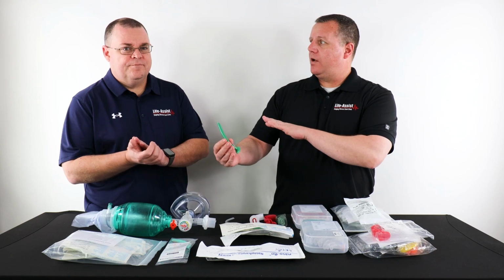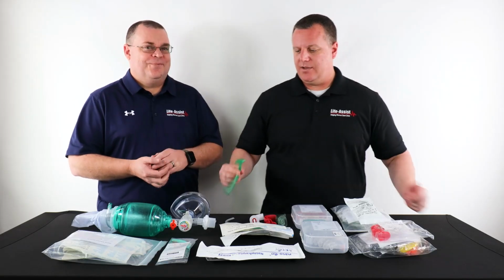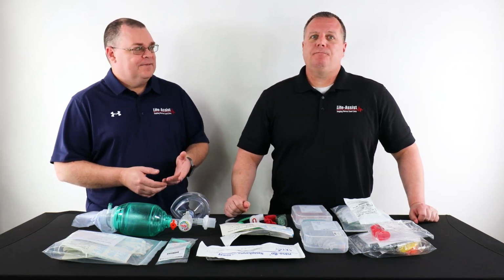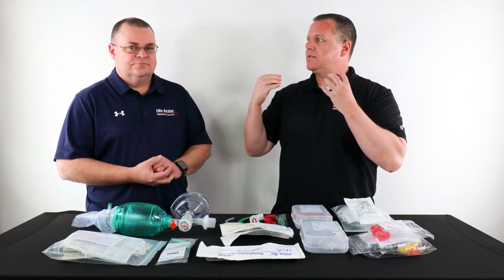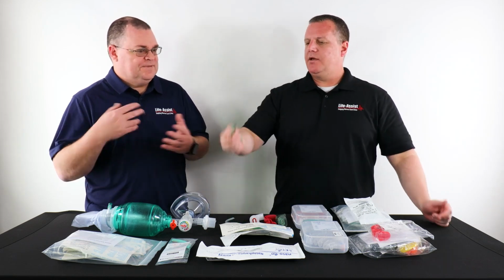Now, don't get me wrong, if someone's conscious and I go up their nose, you're not going to like it. Why do you use the NPA? Same thing. Even when semi-unconscious, everything starts to relax in the body, and the tongue can fall back, blocking that airway. It's the same use.